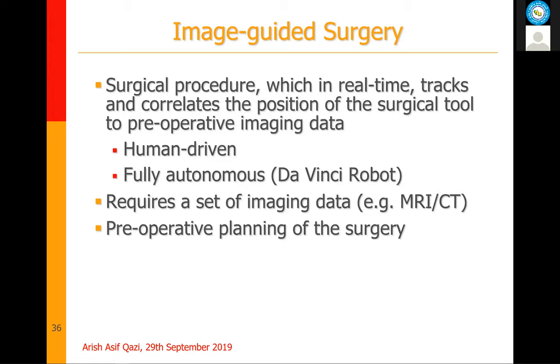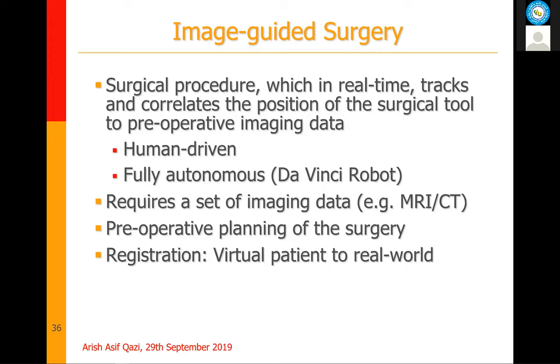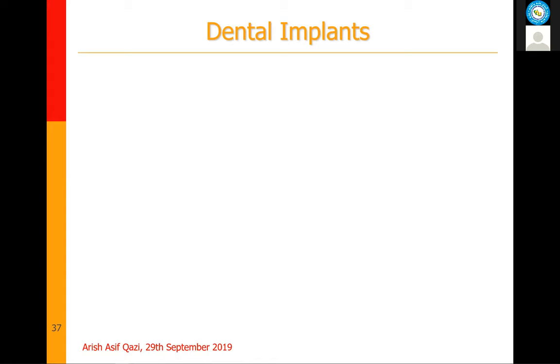Then once you have obtained your data, you do a preoperative planning of the surgery, like where do you want to make the incision? Where is the tumor present? Now, imagine you have these two worlds. You have imaging data, which I would call a virtual patient, and then you have the real world, which is the surgical world, where the patient is lying on the surgical table. Now you want to map from the virtual patient to the real world, and this is done through registration. There are different techniques, but I'll talk about the technique that was developed for our product. And finally, once you have the registration, you can go ahead and do navigation. Navigation would mean that you track the physician's tools and display them in real time onto your imaging data.